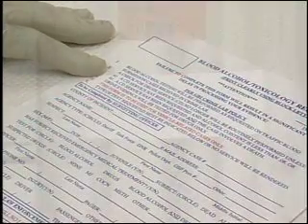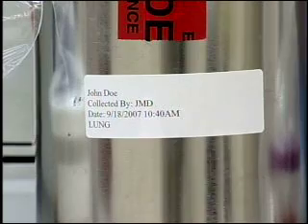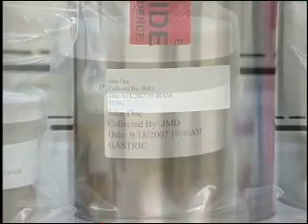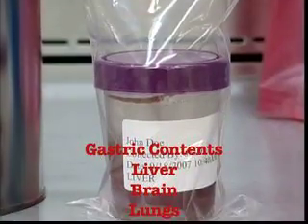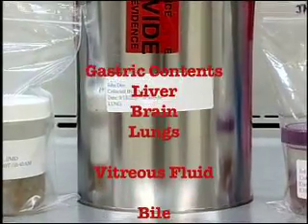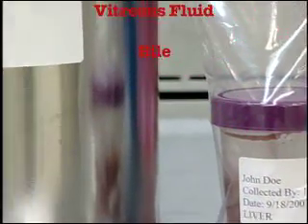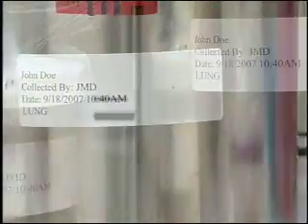In postmortem cases, in addition to blood and/or urine, other types of specimens can be submitted as well. These specimens include gastric contents, liver, brain, lungs, vitreous fluid, which is the clear fluid contained in the eye, and bile, which is the digestive fluid stored in the gallbladder.